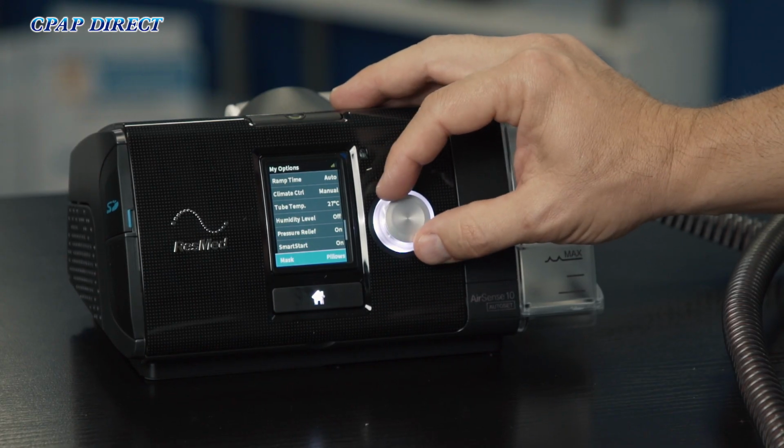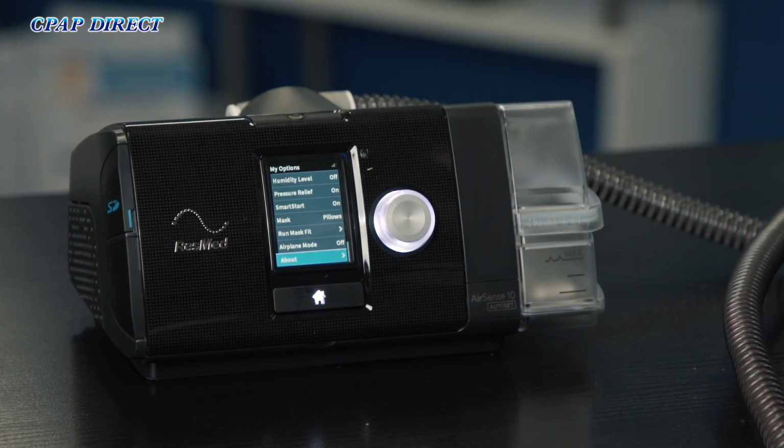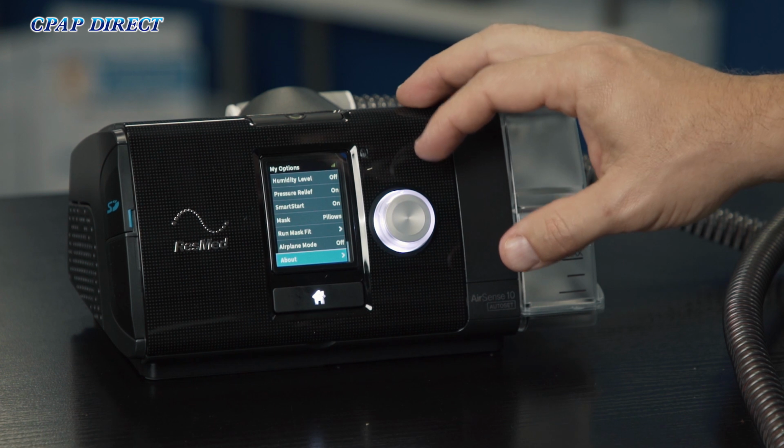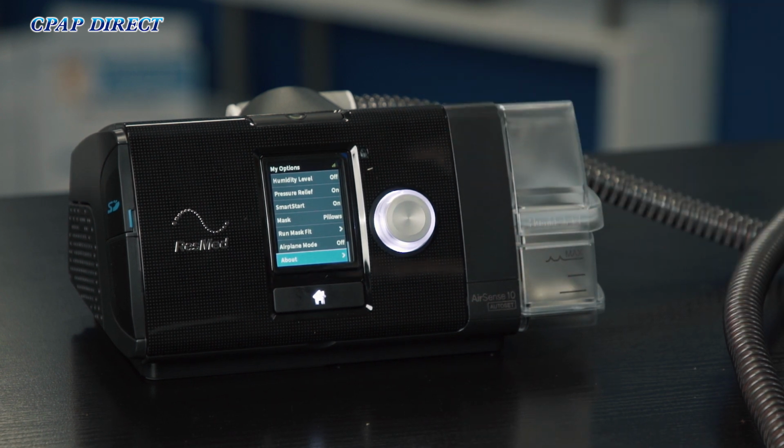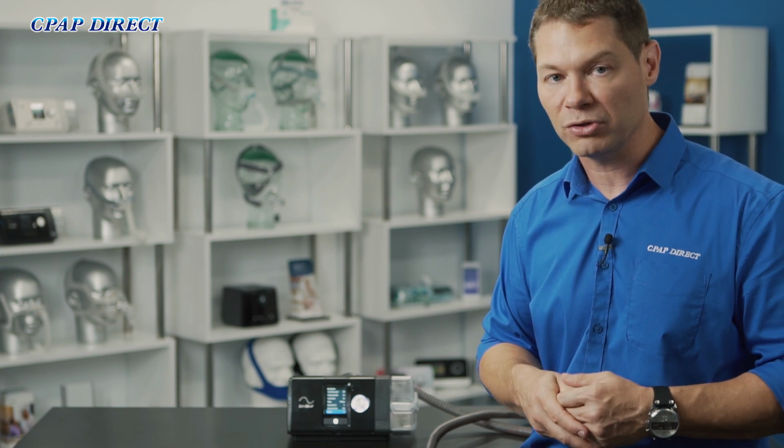If we scroll down to the bottom of the menu, we have Run Mask Fit, which basically puts a higher pressure when you first turn the mask on, and that's really just to make sure that you've got a good mask seal at higher pressures. And we also have Airplane Mode. Airplane Mode turns the modem off. So if you're going to be using the machine on a plane and you have to turn your phone into flight mode, you can also turn your machine into flight mode as well, so it's not trying to upload all of your data to the cloud. Also, if you decide that you don't want to have your therapy monitored, then you can also turn the device into airplane mode as well.